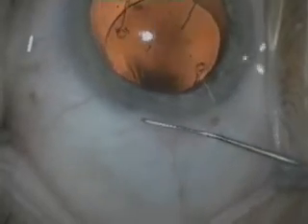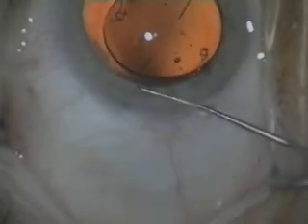Place the tip of the instrument on the inside of the elbow of the trailing haptic and push the haptic through the incision and rotate into the capsular bag.